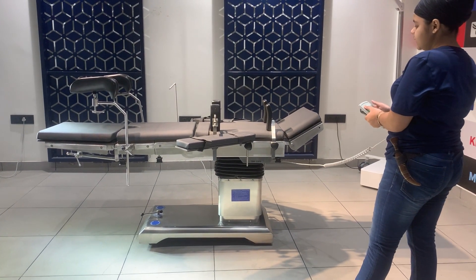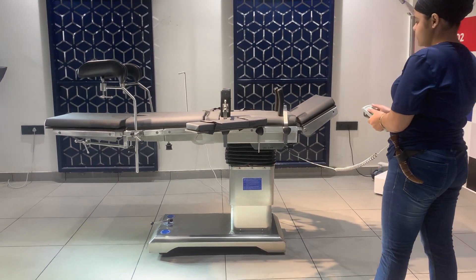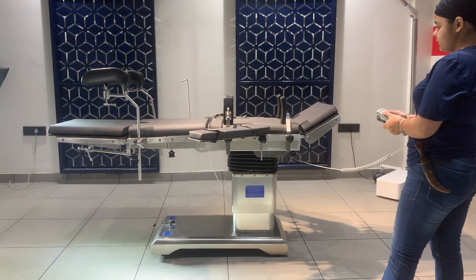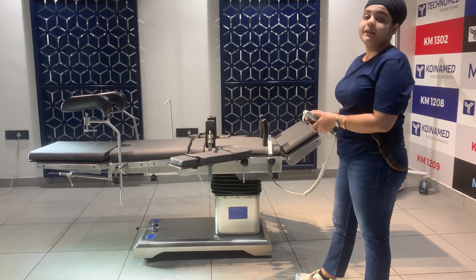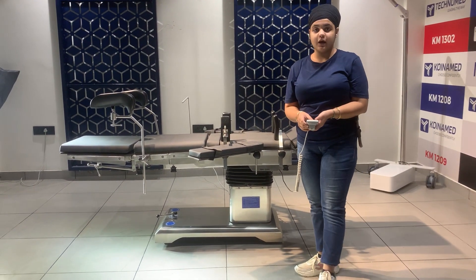Now I will show you the height adjustment on the table — the height is going upwards, and now the table is going downwards. The minimum and maximum height of the table is 750 mm to 1000 mm.